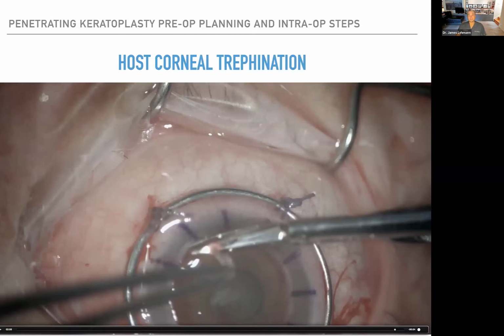Well, the best thing to stop bleeding is air, okay? So what I would do is take a deep breath and calm down. I'd fill the chamber with viscoelastic, and then I'd suture the donor on with 4 cardinal sutures, and then I'd put air in the AC until it stopped bleeding, okay? I would not try to get a retina cautery and go in there and try to cauterize it. I would just do the best that you could at that point.